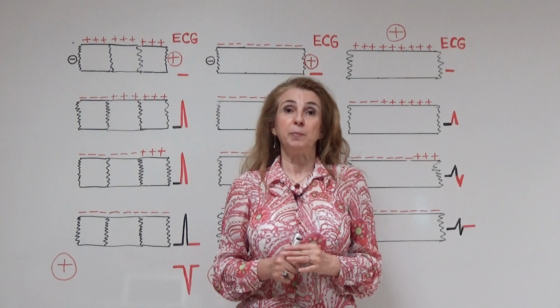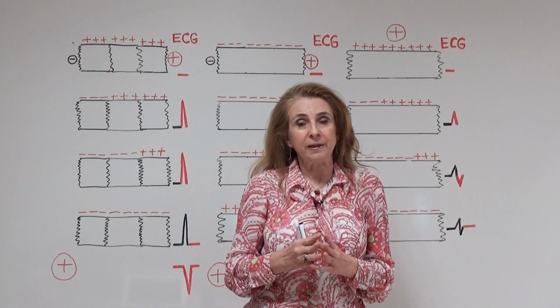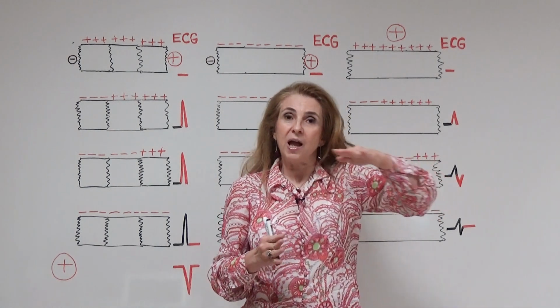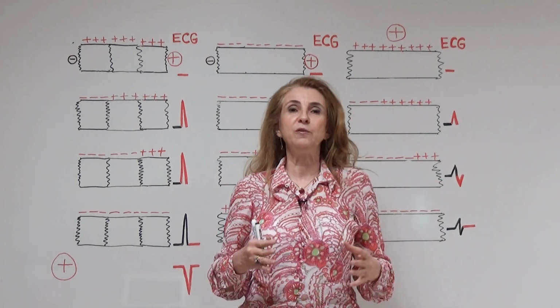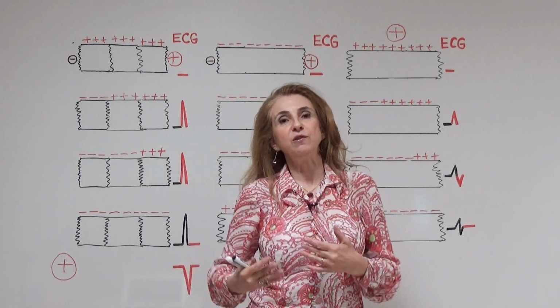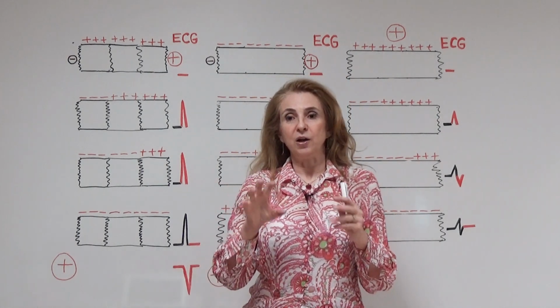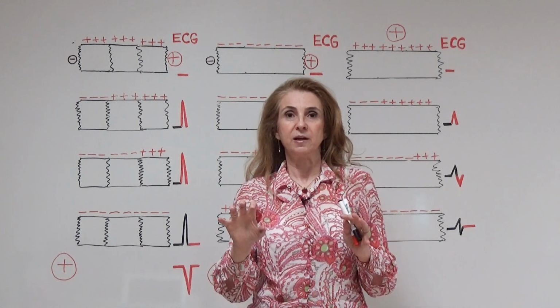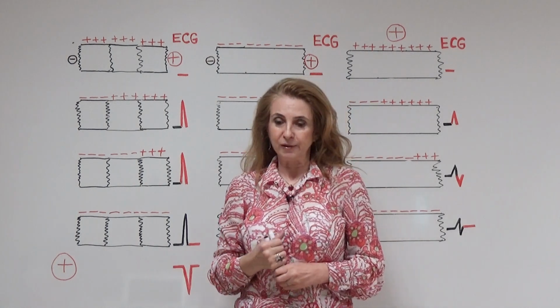No, this is not possible because there is anatomically a fibrous tissue between atria and ventricles, and it acts like an insulator. It prevents the formation of an electrical dipole between the ventricles and atria. So the electrocardiography can measure the dipoles in the atria or in the ventricles. It cannot measure a dipole between atria and ventricles.